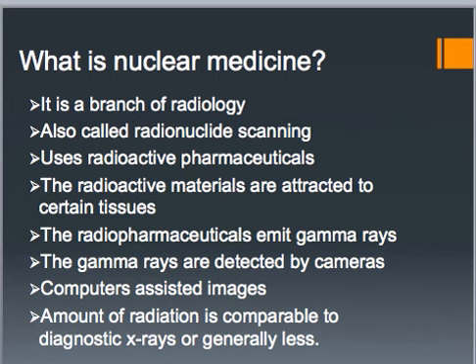The gamma camera is made of a large crystal detector, called a scintillation crystal. These crystals detect the emitted radiation signal coming from the body, and then convert that signal into a faint light. That light is converted into an electrical signal, which is then digitized, or converted into a computer signal, and then reconstructed into an image by the computer. All of that takes place behind the scenes.